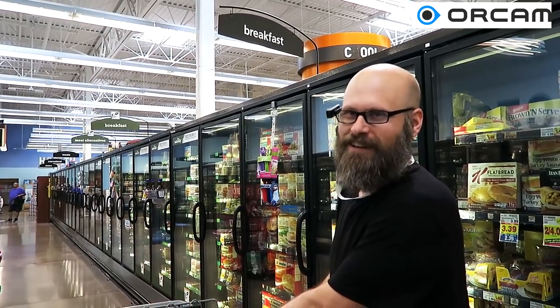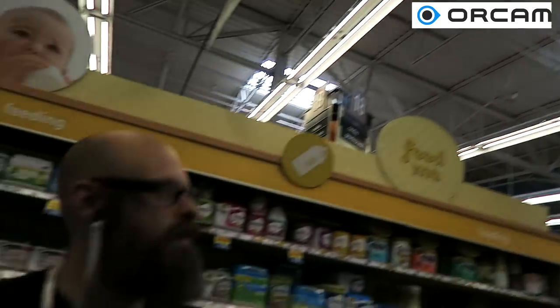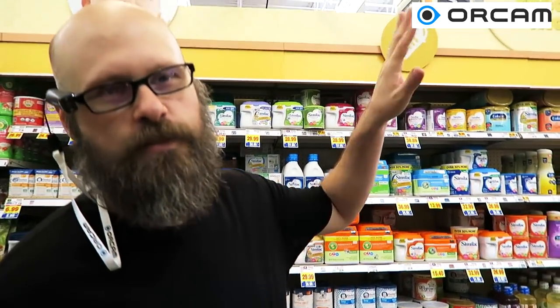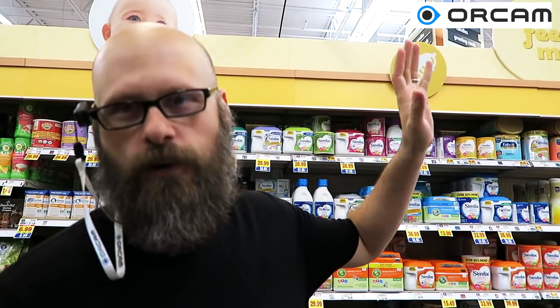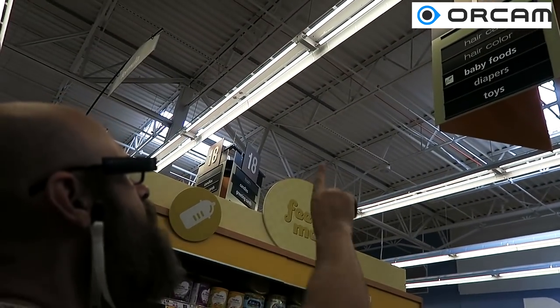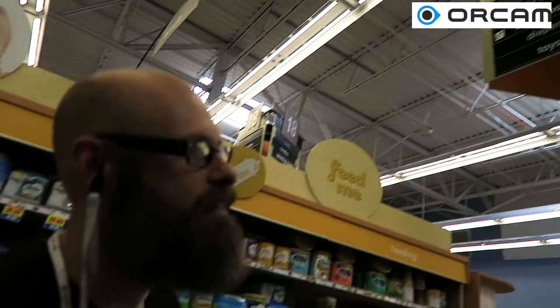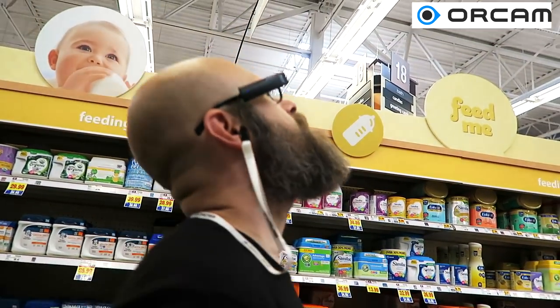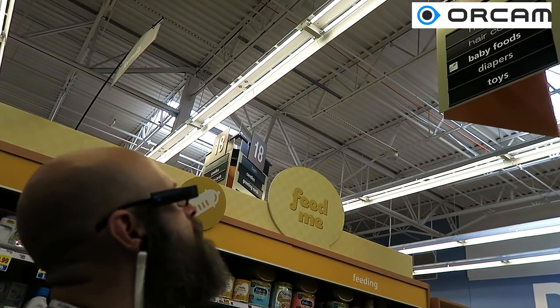This is the breakfast section. All right, let's move to one of the other aisles. Okay, so this is one of those more traditional signs on each of the aisles — way too far away for me to see what it says. We're going to see if the OrCam can read it. Toys. We got toys. There's more up there than just toys, so let's see — it's only saying toys.